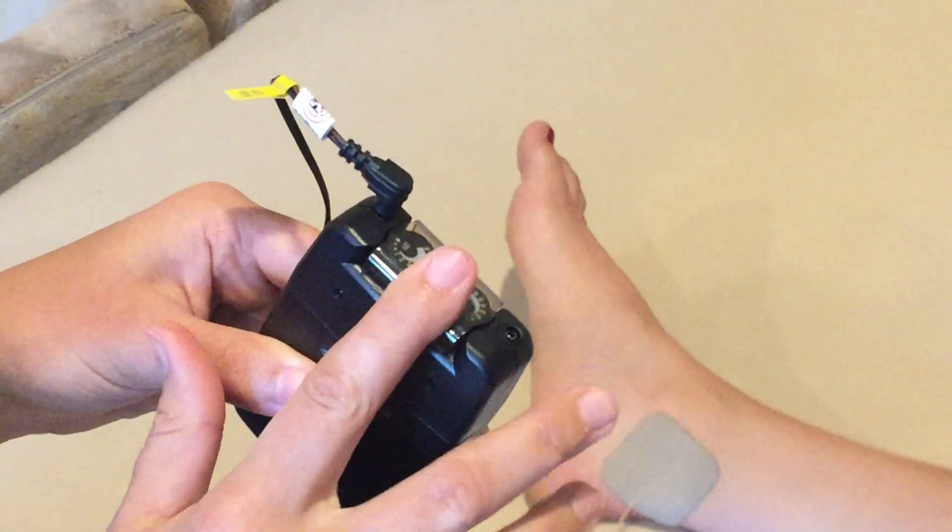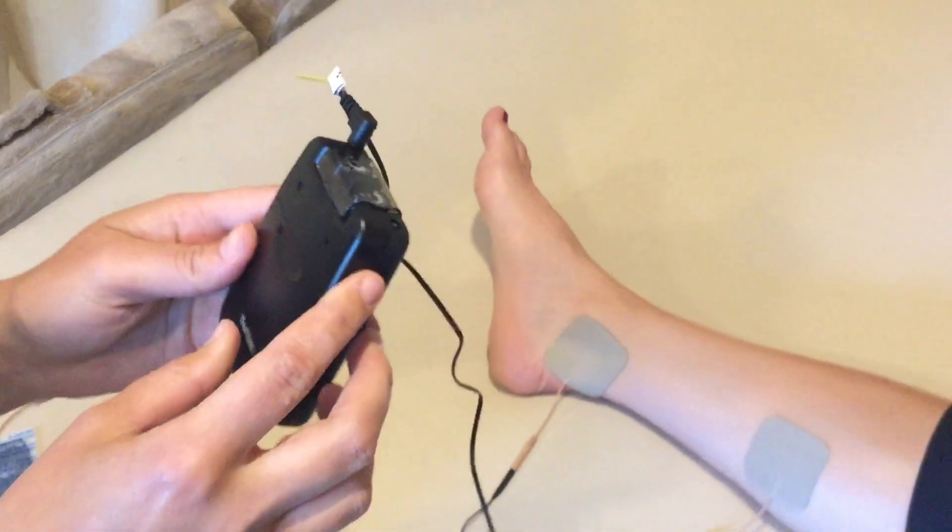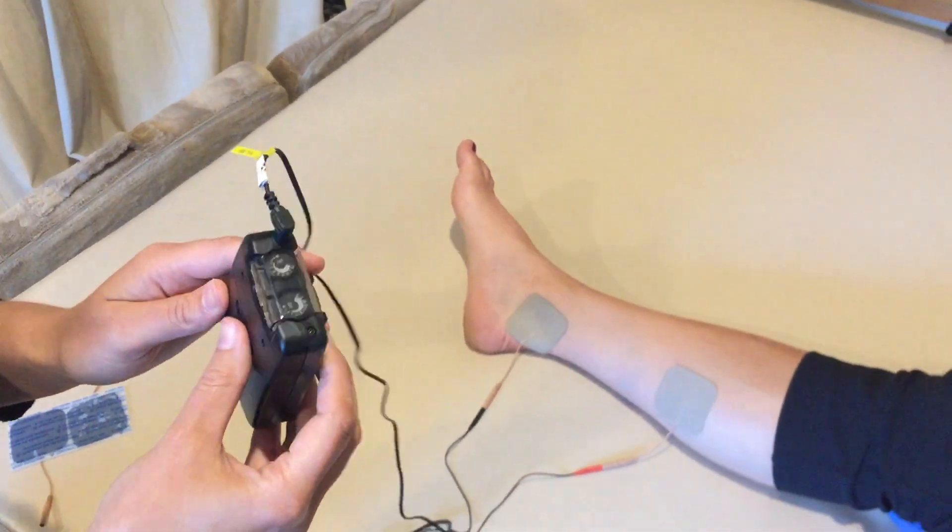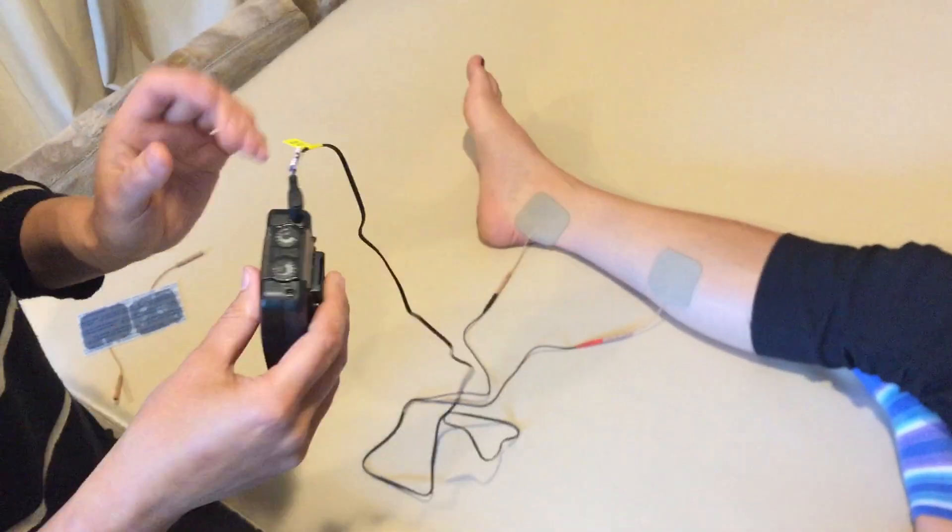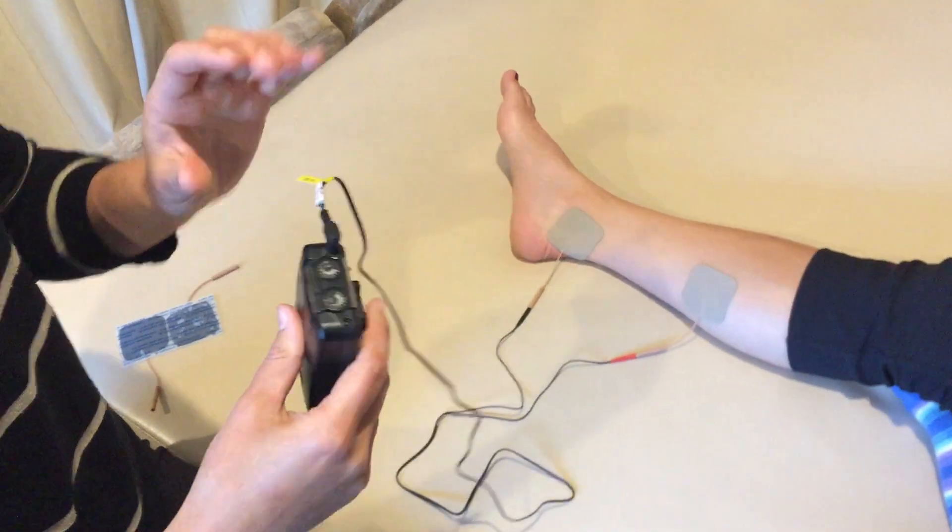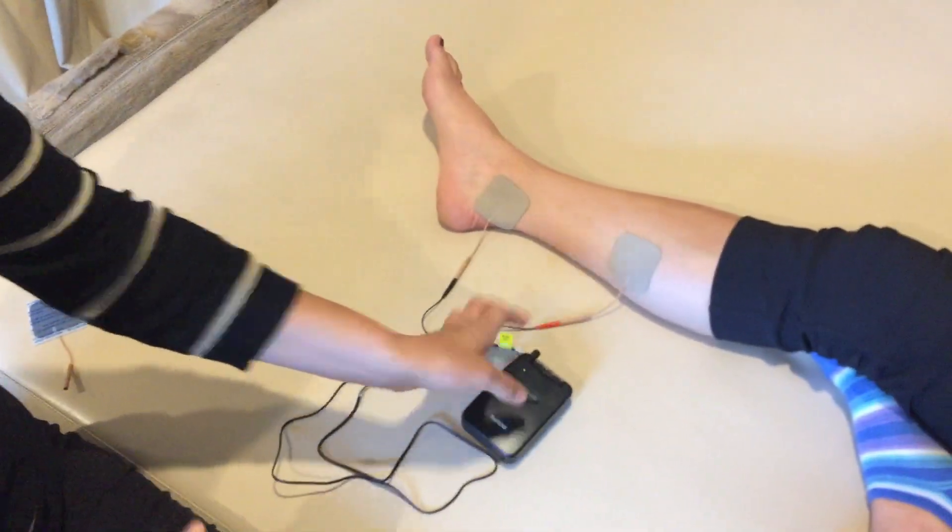Then we can close this and let it sit for a half hour. Make sure you do this three times a week for best results. And that's it.